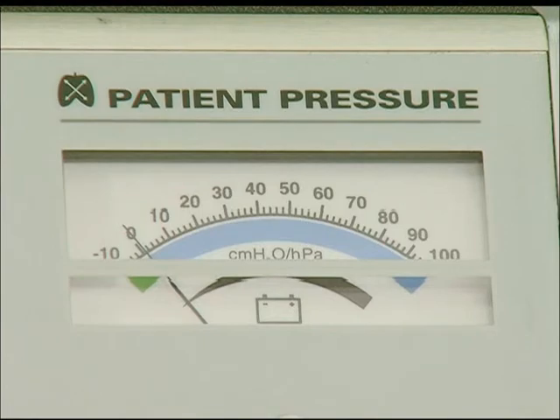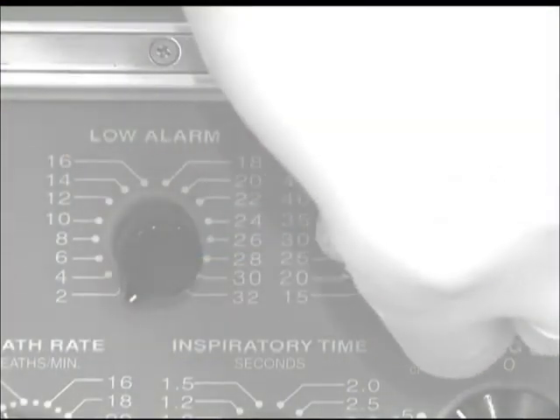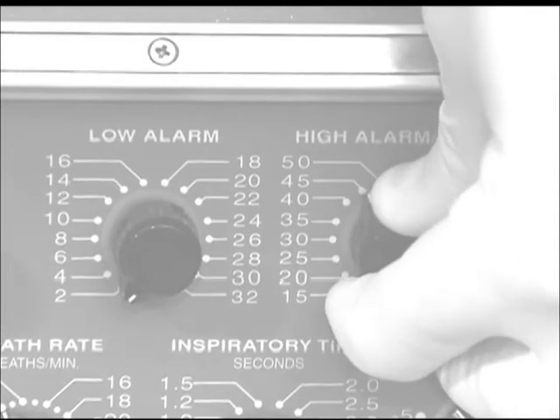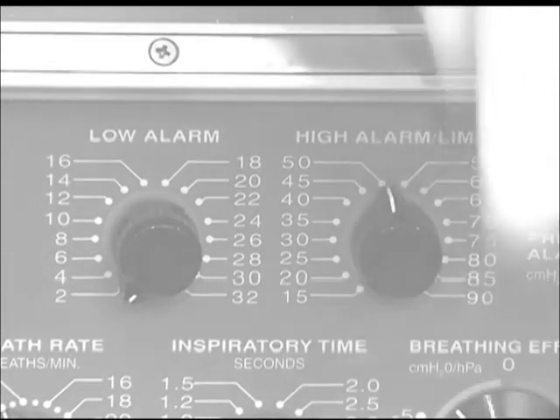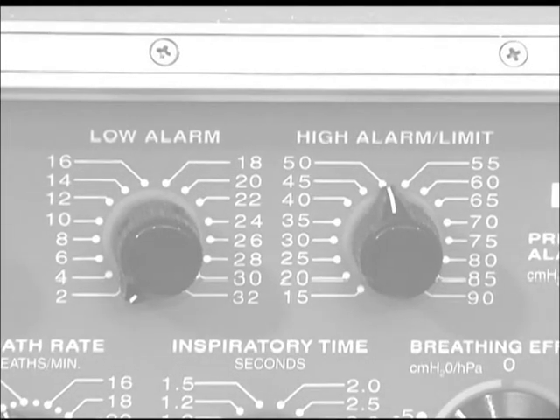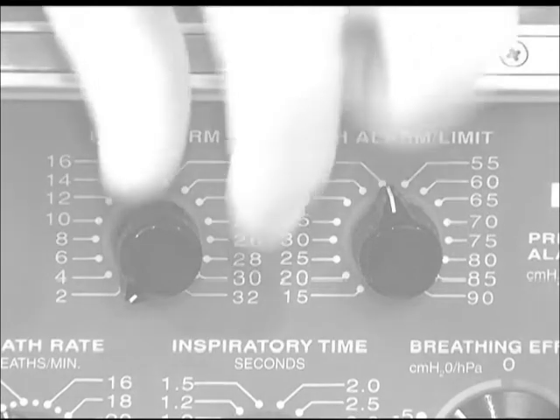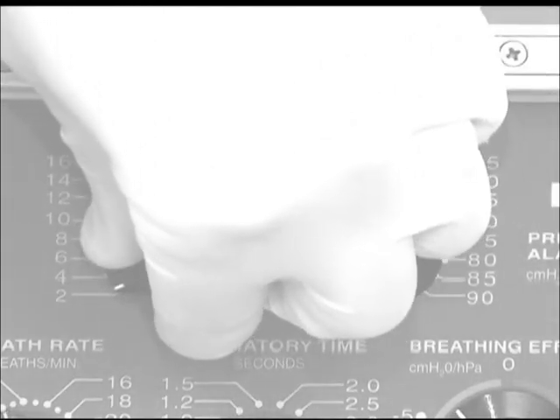At the upper right-hand corner of the ventilator, the peak pressure will be displayed on the analog manometer. Peak pressures over 35 centimeters of water should be reported to the appropriate care provider. Reset the high pressure alarm 10 to 15 centimeters of water above the average peak airway pressure noted. The low pressure limit should be adjusted 5 to 10 centimeters of water above the pressure noted at the end of the expiratory phase, usually 5 to 10 centimeters of water unless external PEEP is applied. If PEEP is ordered, contact the appropriate care provider for assistance.